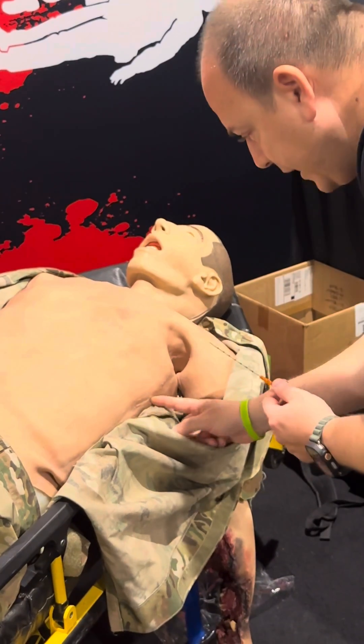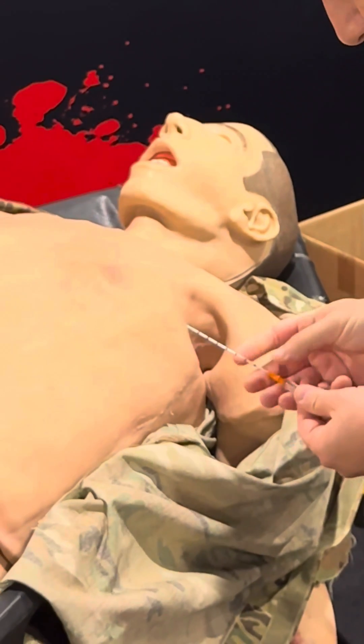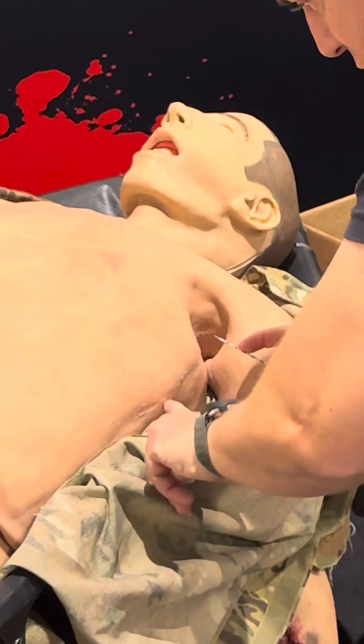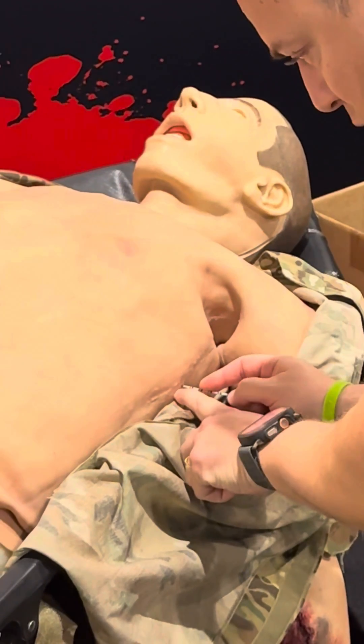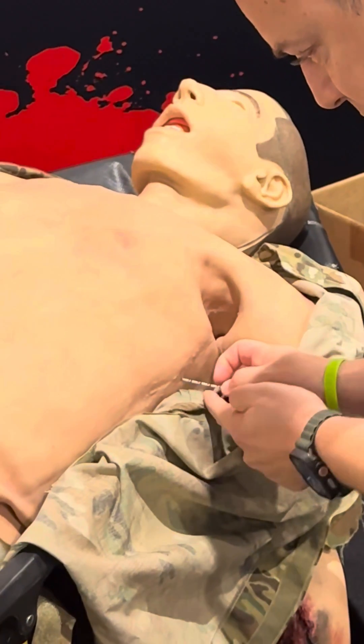I'm going to show you from this angle. I want to grab this and facilitate it with my finger here. This is the rib — I'm aiming for the rib. Once I reach that rib, this rib is obviously a little closer, so I then go back to the three-centimeter mark.